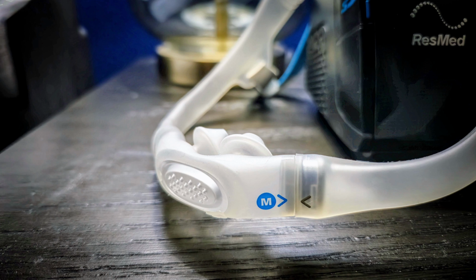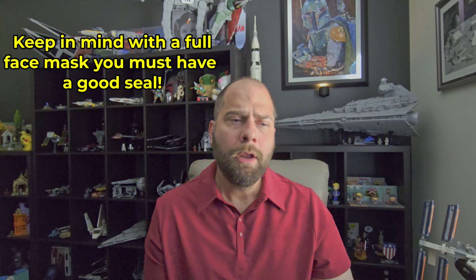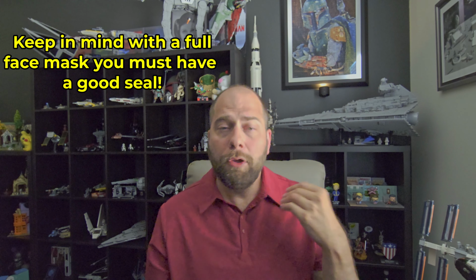So when I say airflow, usually this tends to be with people that are using nasal pillows or nasal masks, right? Those are the ones that go under your nose and the ones that go over your nose, not covering your mouth. That'd be an oral nasal or full face mask. So why is that? Well, if you open your mouth with a nasal pillow or a nasal mask, that airflow is going to be greater than when you weren't even using the CPAP. So now you've got this intense flow of air going up your nose and out your mouth. That's going to make your mouth and throat even drier than when you were not using your CPAP.